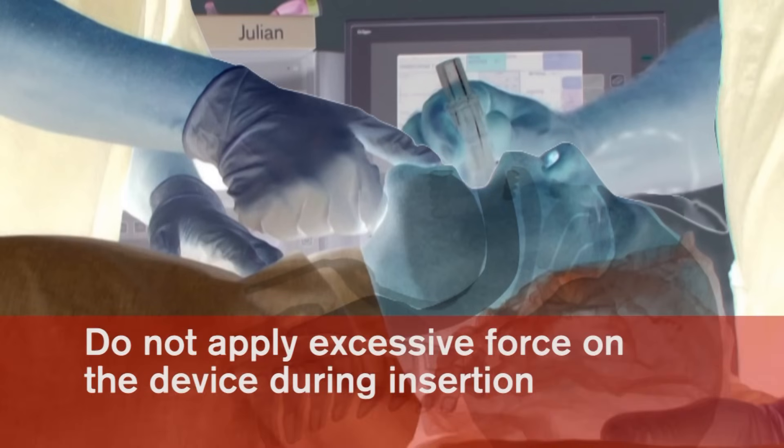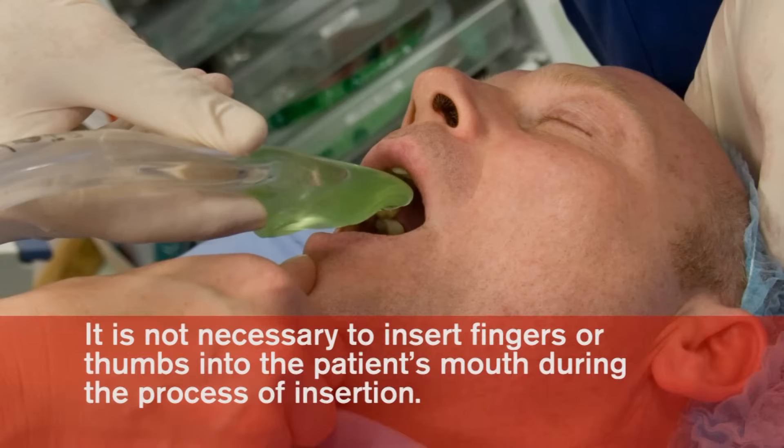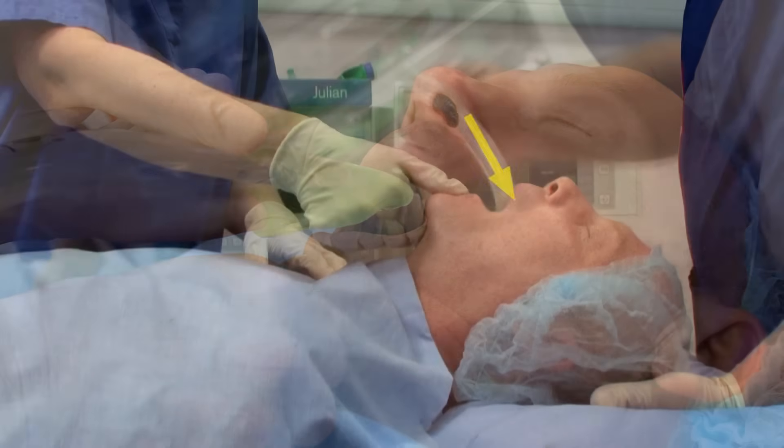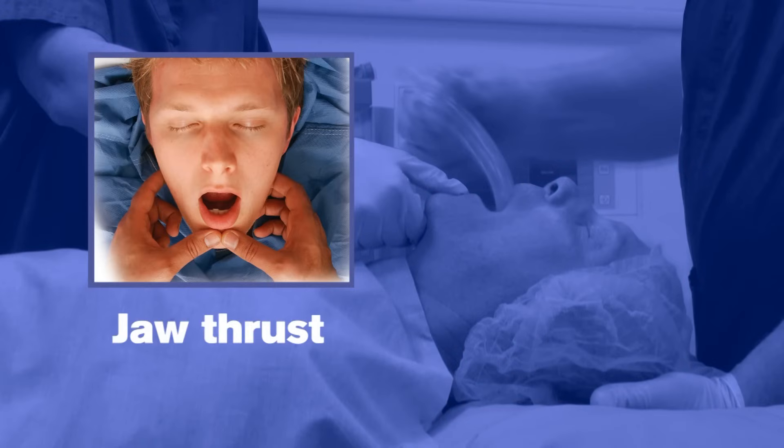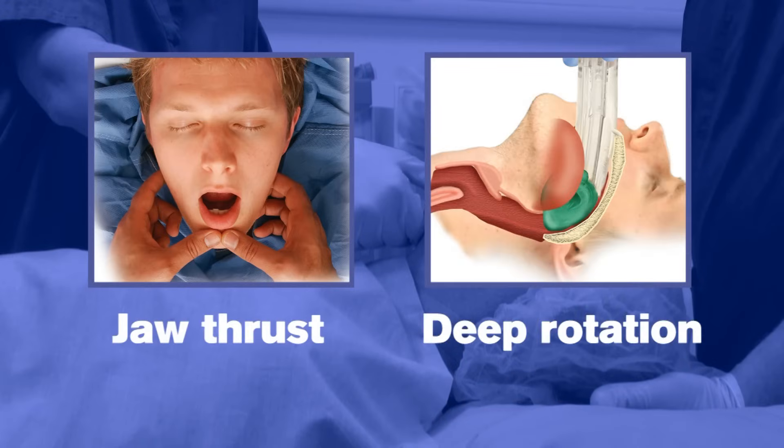Introduce the leading soft tip into the mouth of the patient in a direction towards the hard palate. Glide the device downwards and backwards along the hard palate with a continuous but gentle push until a definitive resistance is felt. Do not apply excessive force on the device during insertion. It is not necessary to insert fingers or thumbs into the patient's mouth. If there is early resistance during insertion, a jaw thrust or insertion with deep rotation is recommended.